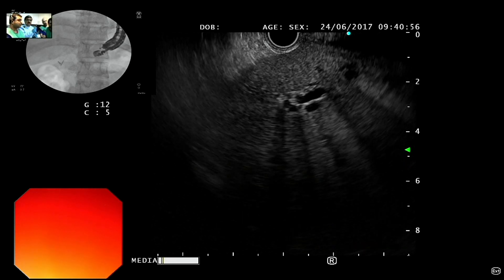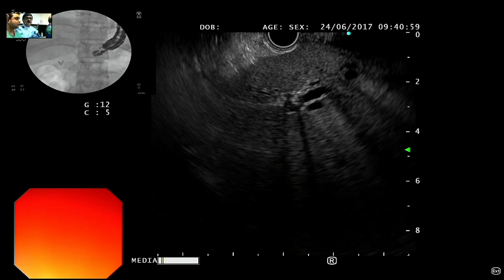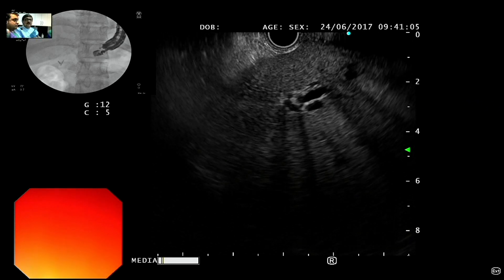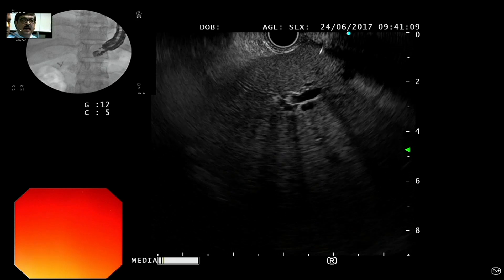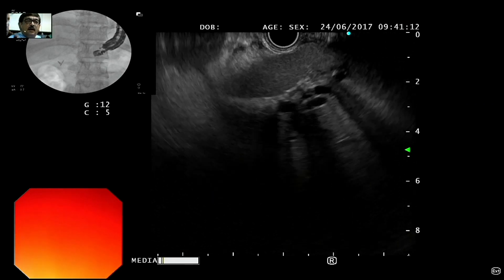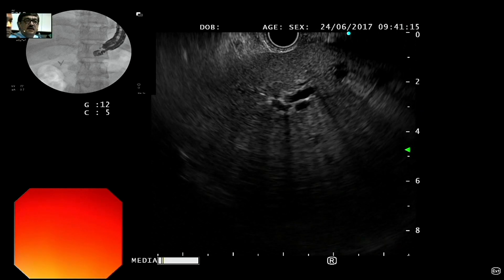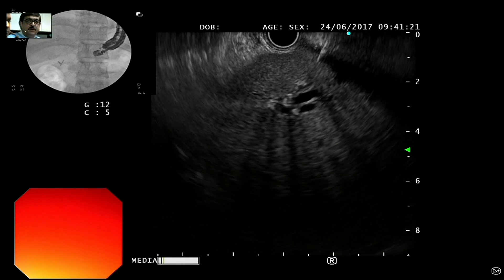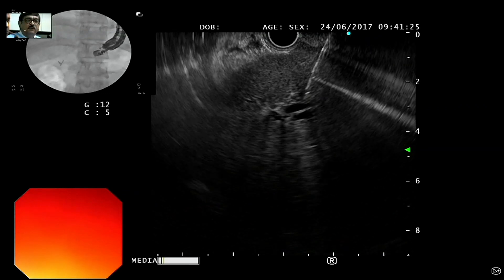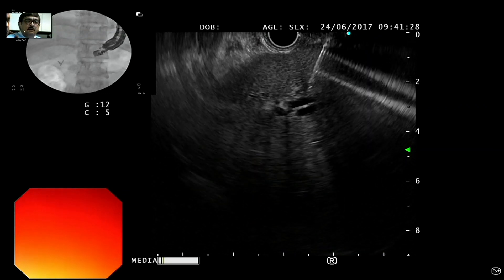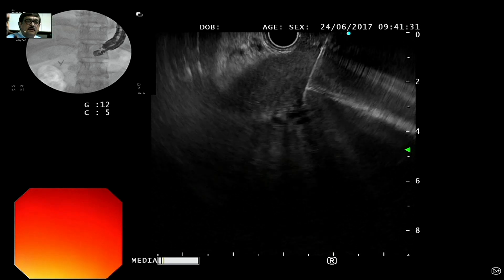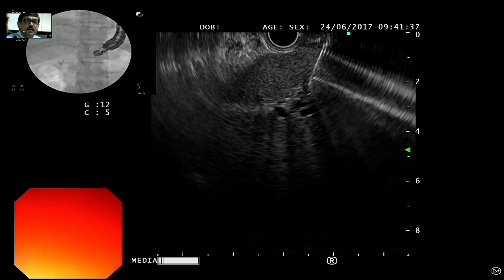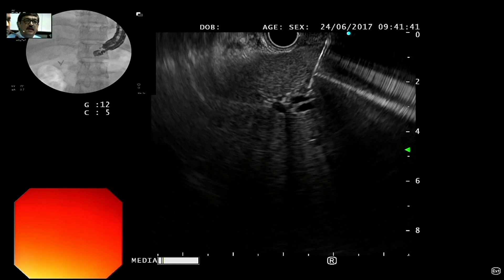I am trying to get a good position, changing the right and left of the scope, making little adjustments. It is very important to see that you are in the right axis and not far away from the target position, so you need to spend some time on this. I think this should be okay. I am in the liver now and will try to go into the biliary system. You see the IHBD has a thick wall — I am almost there. I think I am in.